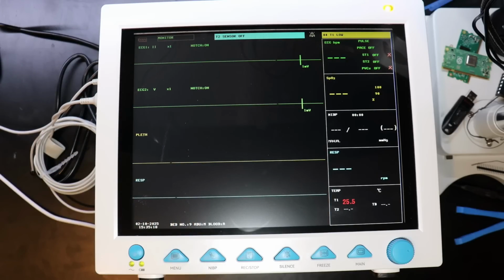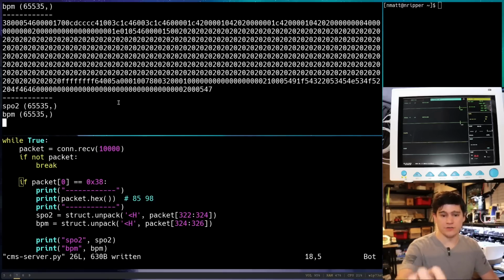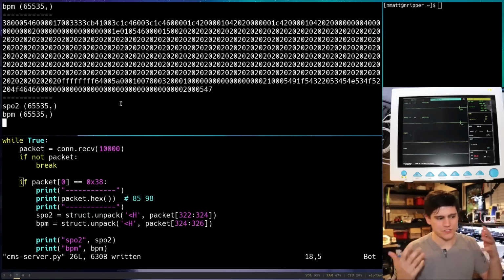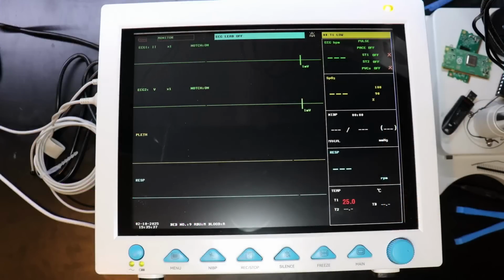And this is going to be a little bit of a challenge because that is a floating point. That's not going to be as easy to decode as a straight up integer. And so what I want to do is I want to find, again, it's going to be in this same packet. You can just believe me. I've been reverse engineering this for hours. And so let's let this stabilize actually. Okay, so 25, okay, so 24.9, okay.